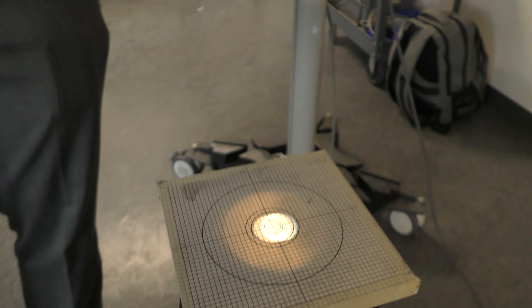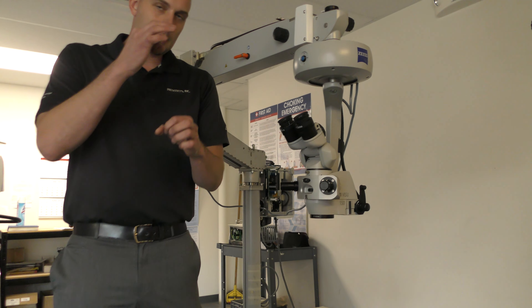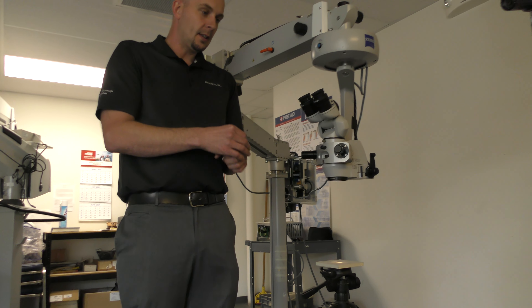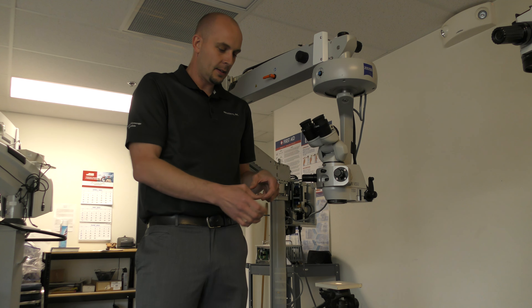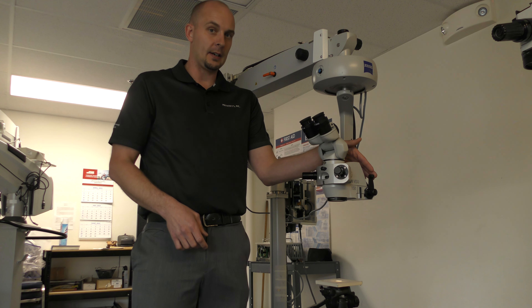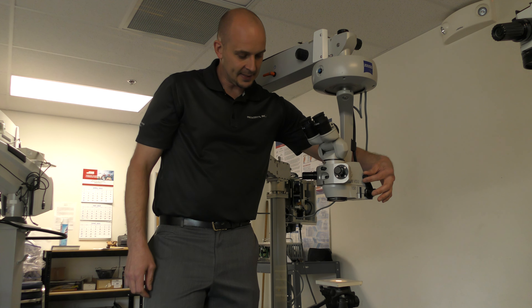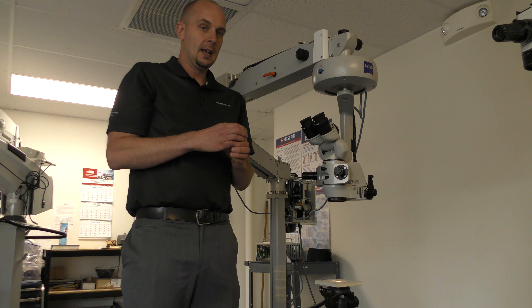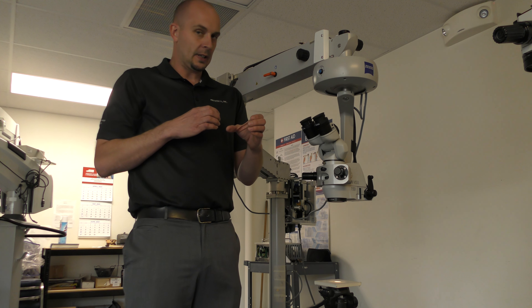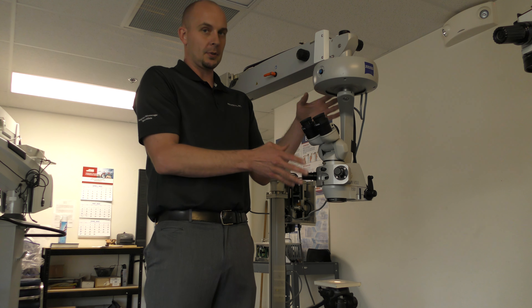On the ophthalmology scopes, what should be happening is the light should be centered exactly in the same way that it's centered when you look through the optics. The secondary light — if there is a secondary light, say on the Vizu systems there is, and its control lever is here — the secondary light should overlap perfectly on top of the main light. If there's any sort of deviation, if it's shifted low, shifted high, or off to the left or right, you would send in the whole optical head.